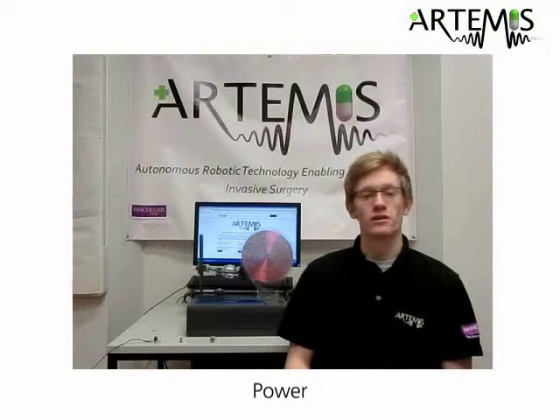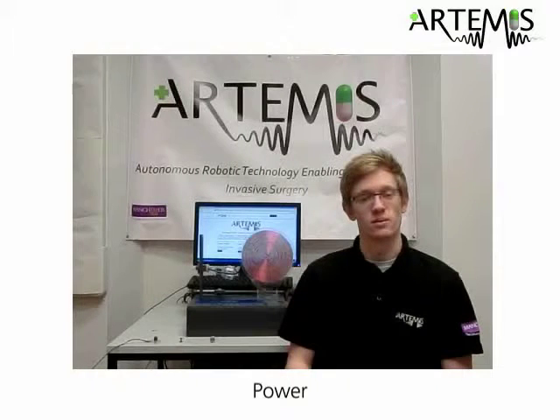To prevent the need for relying solely on silver oxide batteries within the capsule, it was decided to focus on inductive charging to provide a continuous source of power through a portable power system. Inductive charging relies upon a known and calculated alignment, which is where our surgical capsule presents an interesting challenge due to the changing capsule orientation within the stomach.